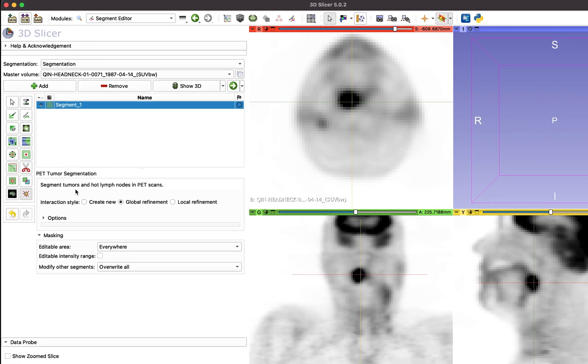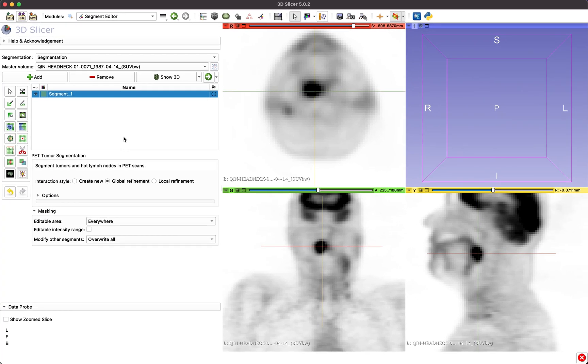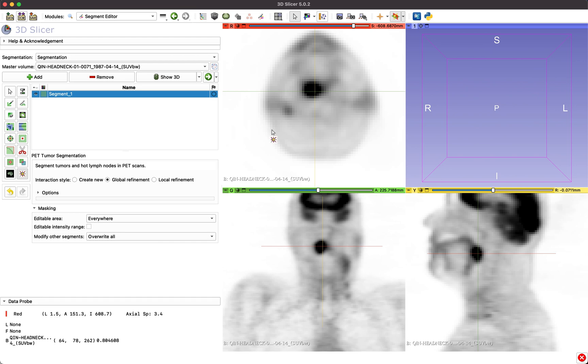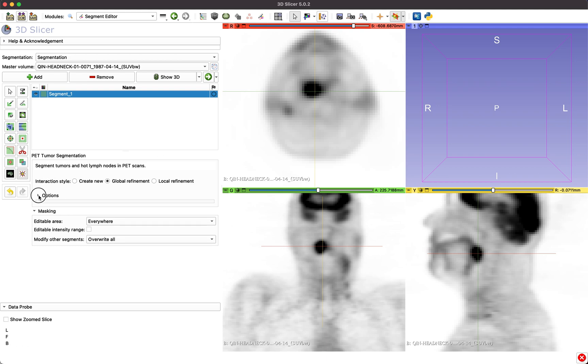The cursor icon will change, indicating that the PET Tumor Segmentation Tool is now active, and the tool's option pane becomes available.